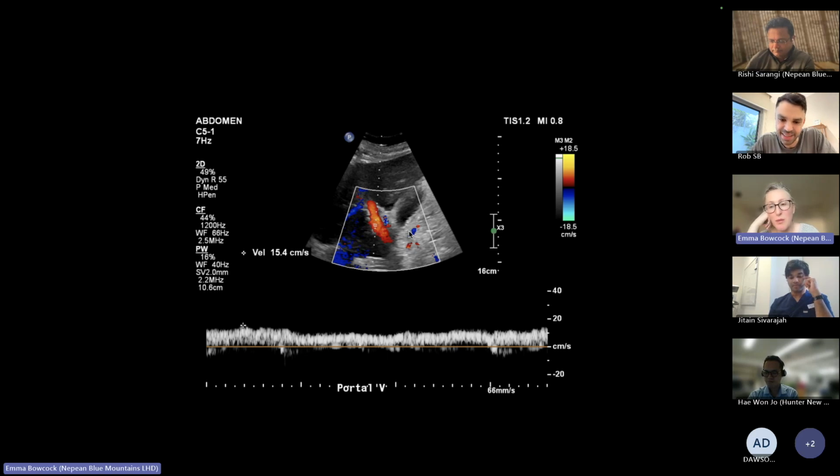They think she's got pneumonia. So what would you tell them about your findings to try and convince them when you've done the ultrasound yourself? So I would say that I can see there is increased wall thickness to the gallbladder with evidence of gallstones and pericholecystic fluid. And I'm not convinced of the pneumonia, I guess. I'd need to review the patient. It's difficult to answer that question, but I would tell them that there is evidence. Depending on what other information you can give me, Emma, if they're Murphy sign positive with the ultrasound probe, then I think that might help us convince them.